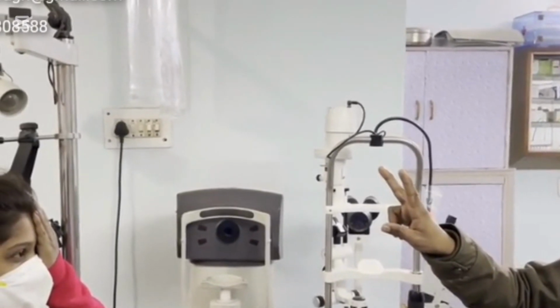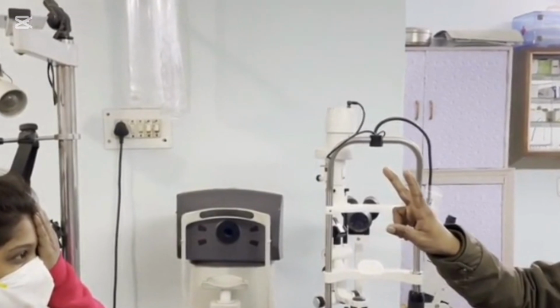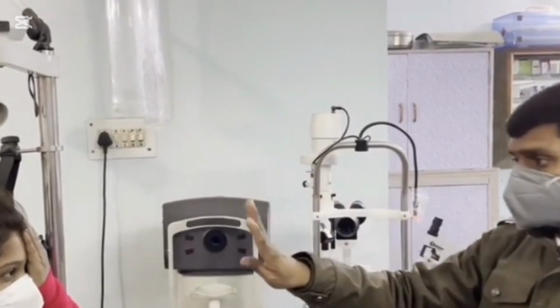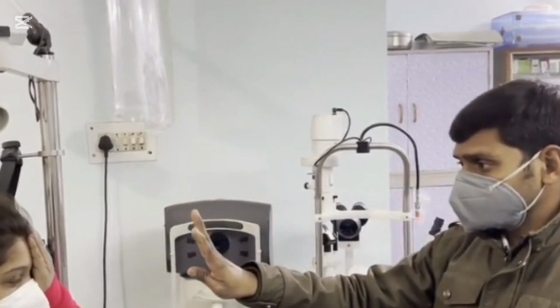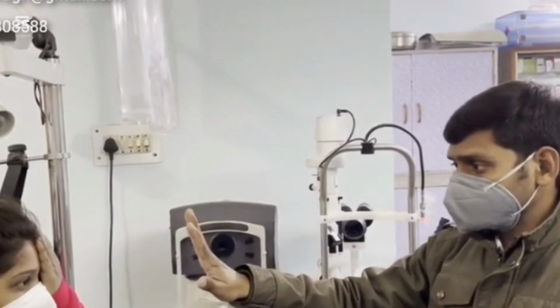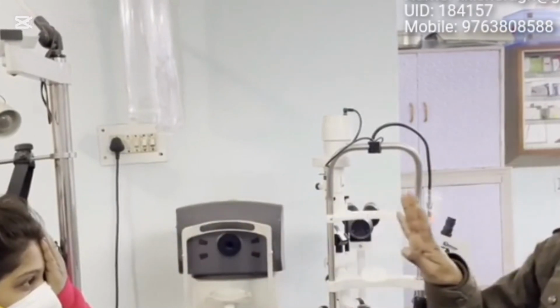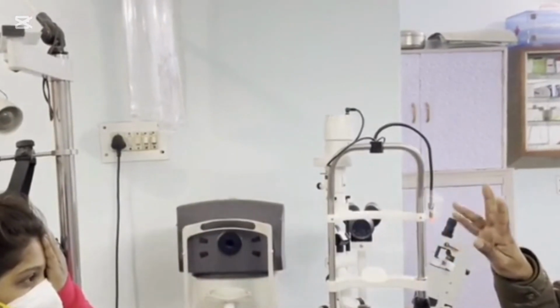If the patient is unable to read the top line even from 1 meter, he is asked to count fingers of the examiner. His vision is recorded as counting fingers from 3 feet, counting fingers 2 feet, counting fingers 1 feet or counting fingers close to face, depending upon the distance at which the patient is able to count fingers.